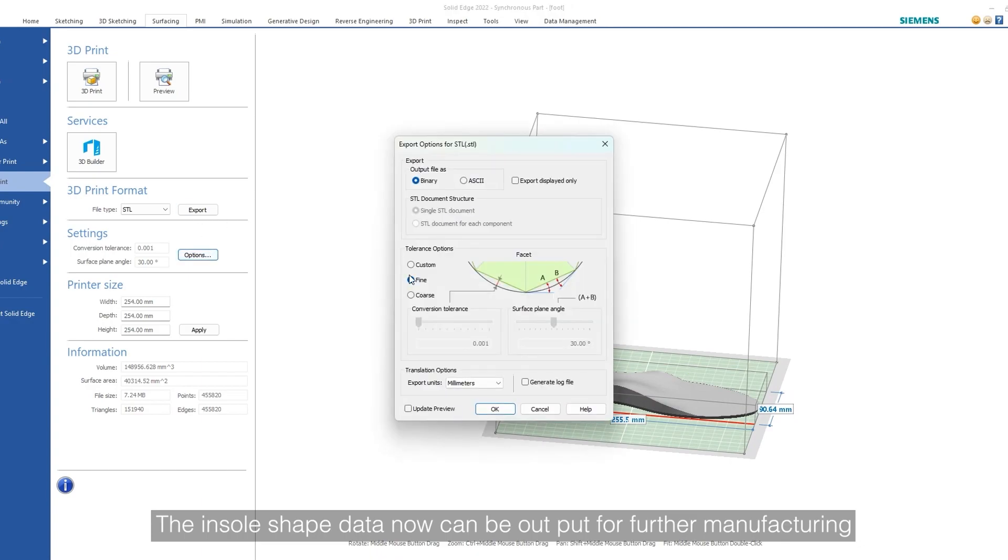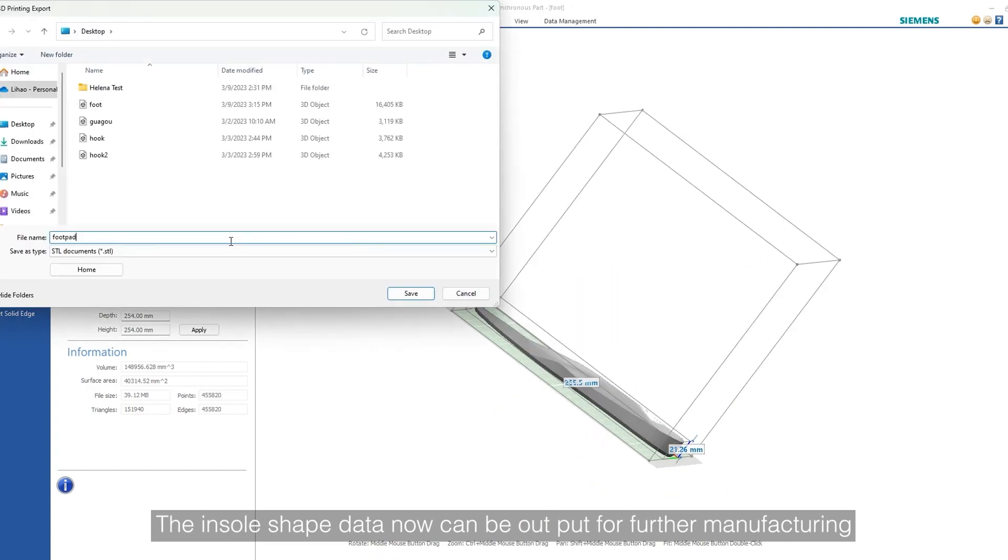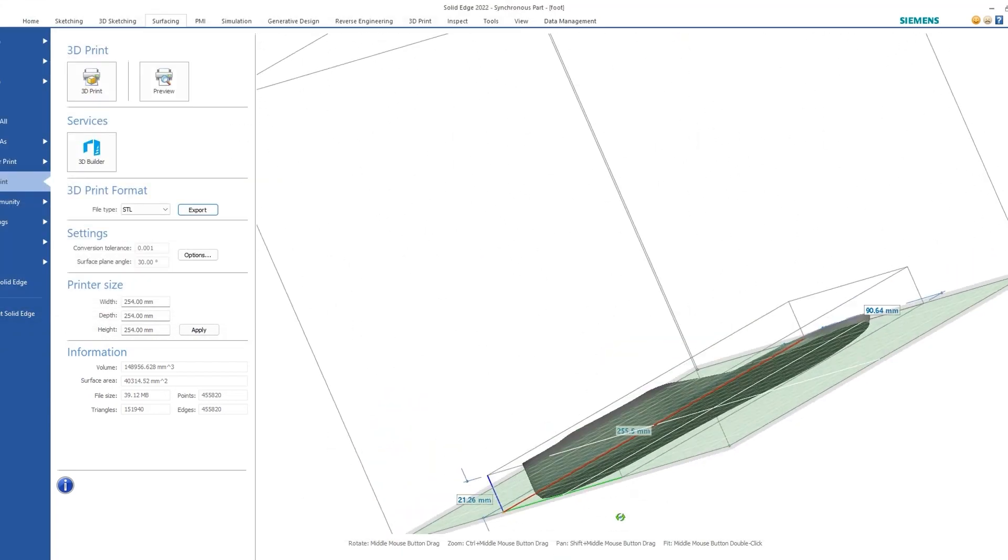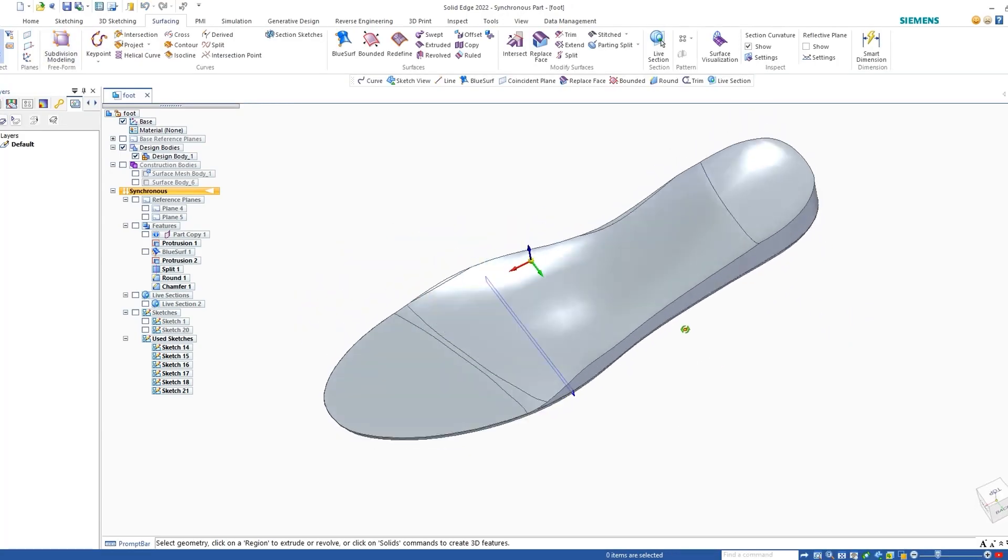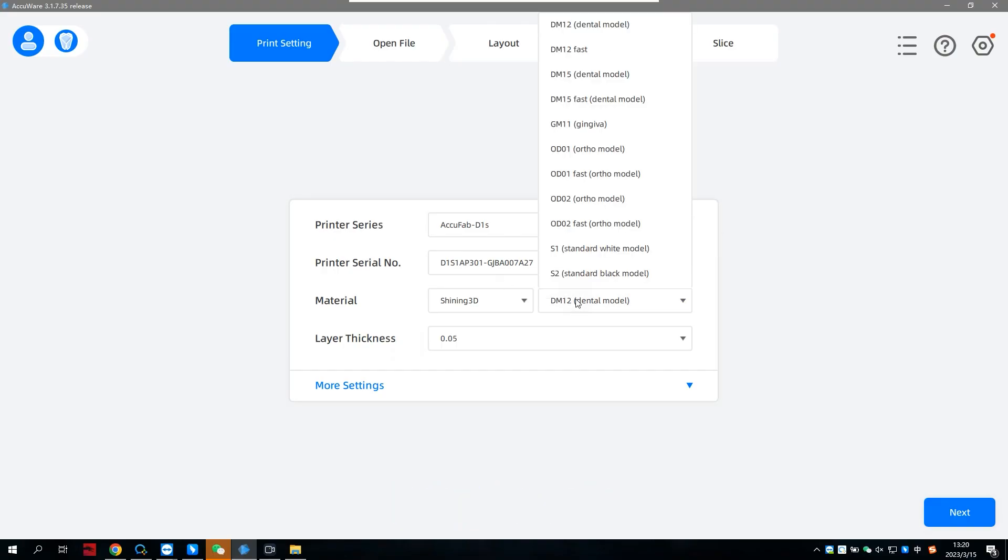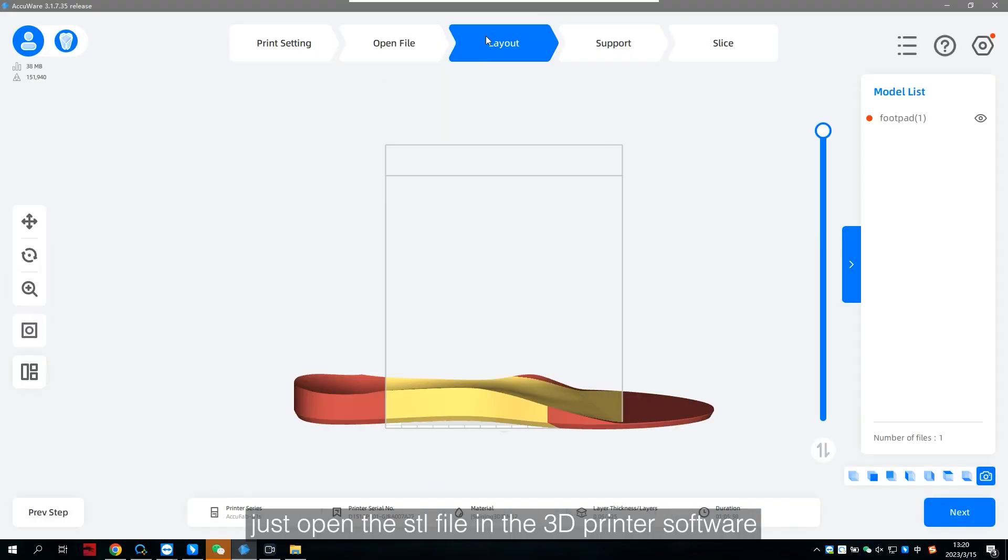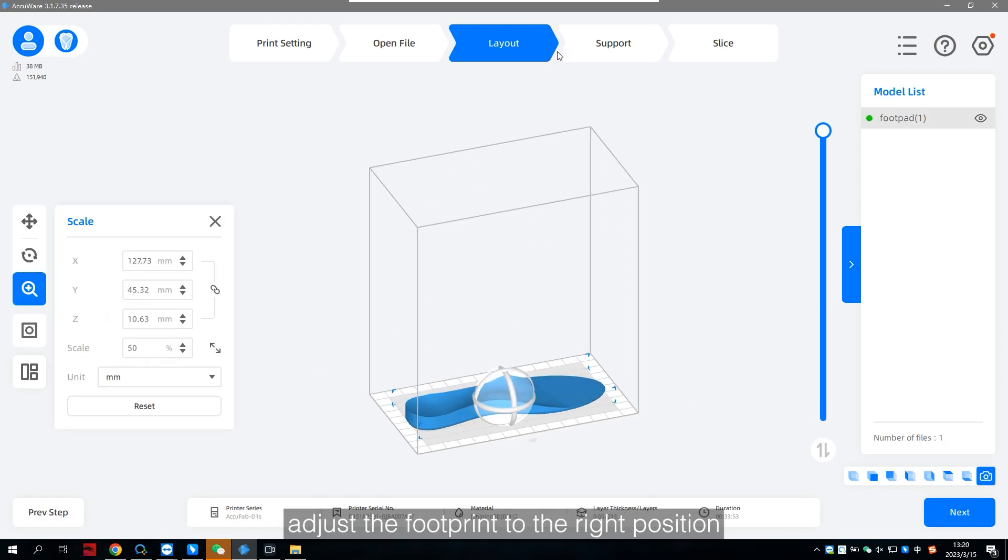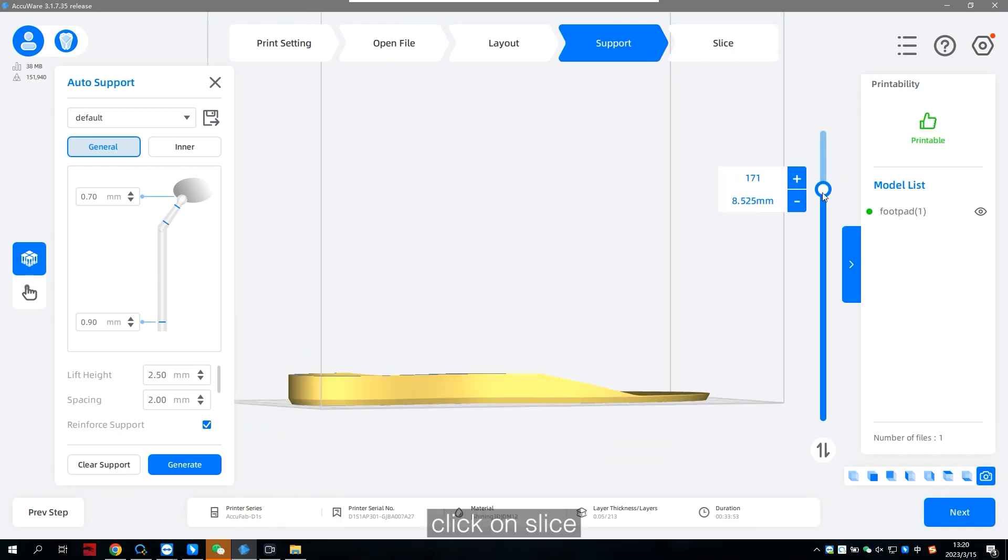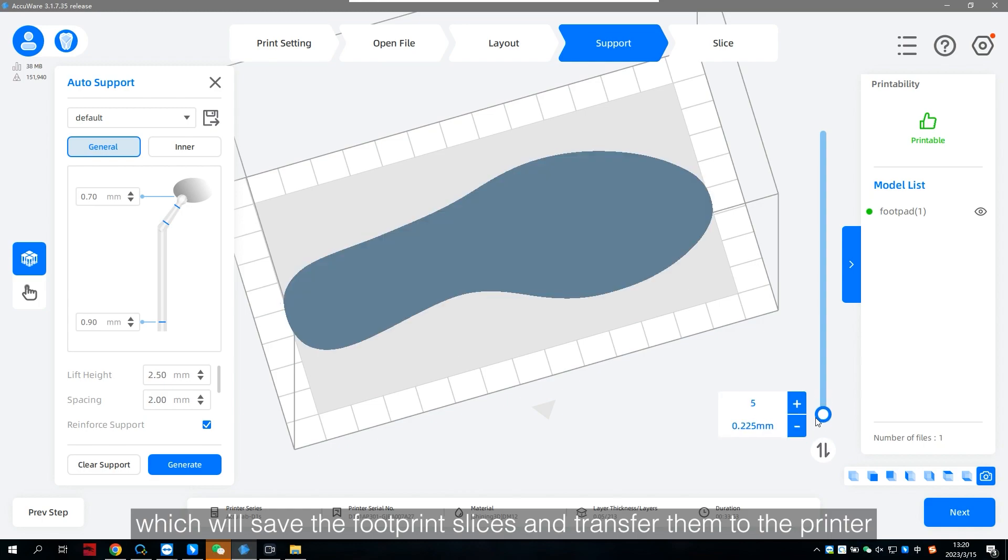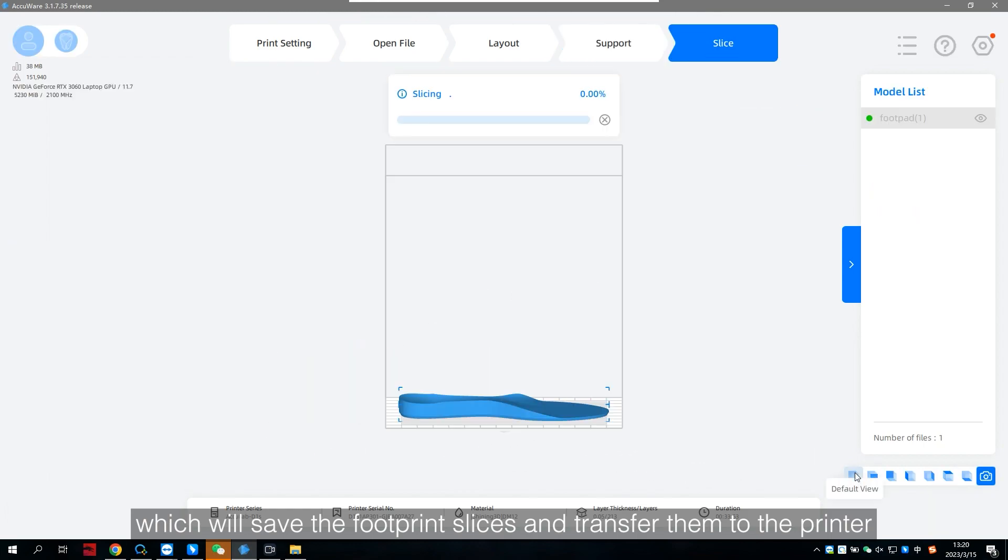The insole shape data now can be output for further manufacturing. Just open the STL file in the 3D printer software. Adjust the footprint to the right position. Click on slice, which will save the footprint slices and transfer them to the printer.